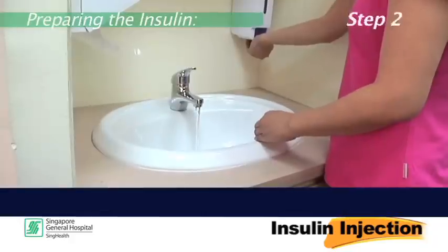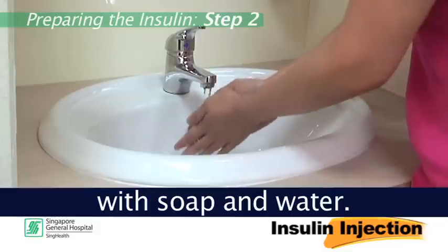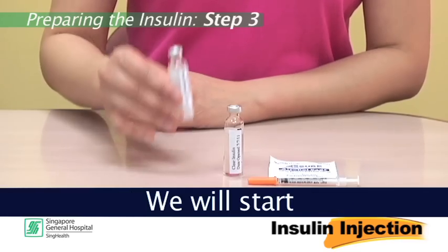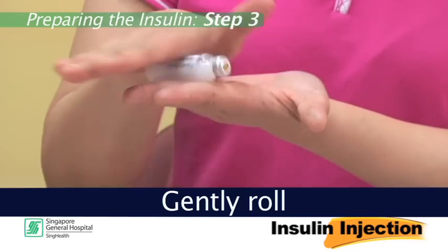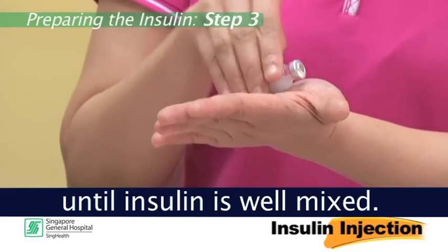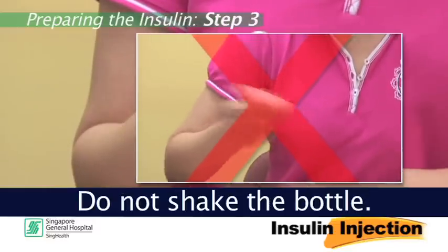Step 2: Please wash your hands with soap and water. Step 3: We will start with the cloudy insulin. Gently roll the cloudy insulin bottle between the palms of the hand until insulin is well mixed. Do not shake the bottle.